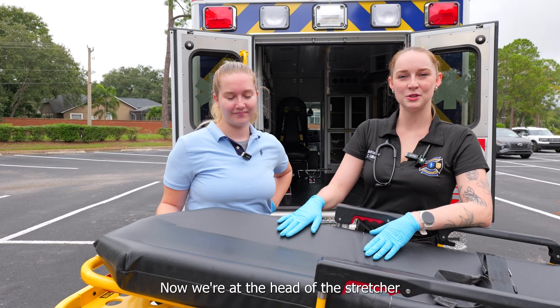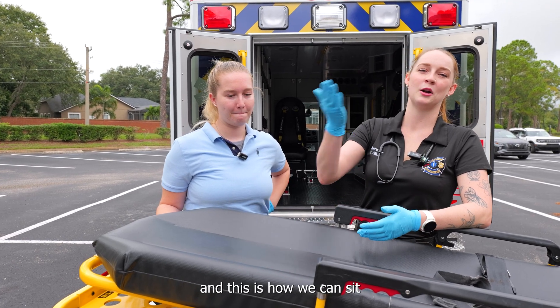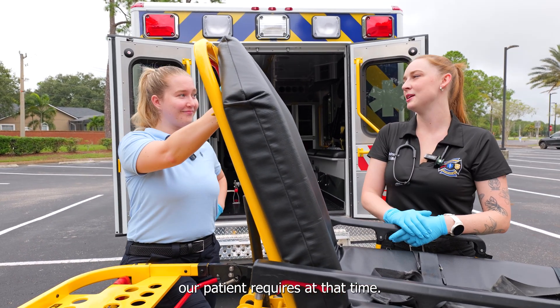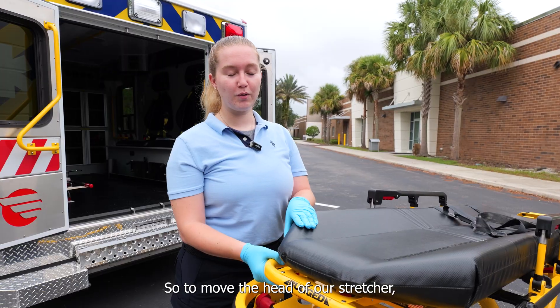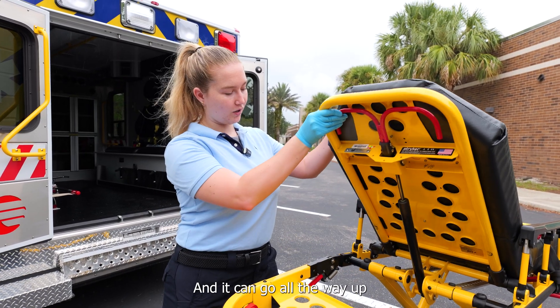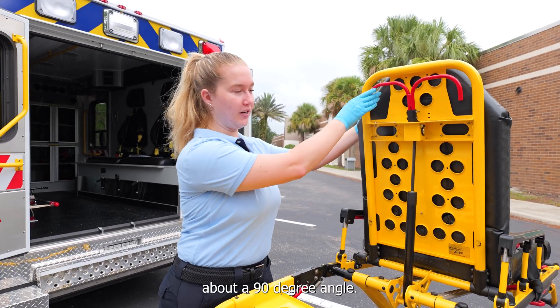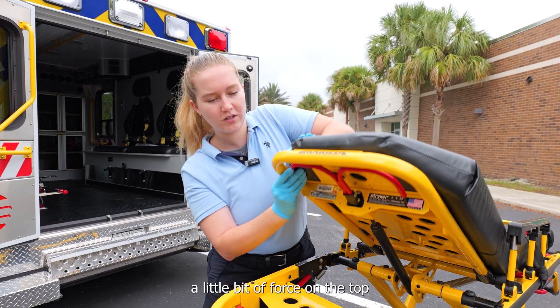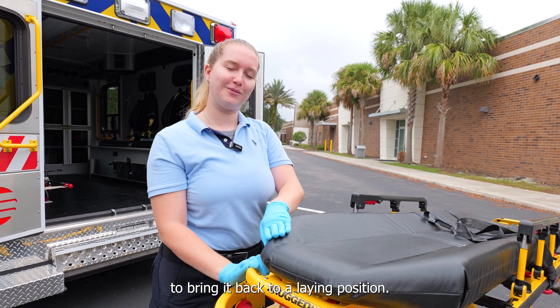Now we're at the head of the stretcher and this is how we can sit our patient up or lay them down depending on what our patient requires at that time. To move the head of the stretcher, we use this red lever and push it in towards the patient — it can go all the way up to about a 90-degree angle. Then to bring it back down, you do the same thing: push this in towards the patient and you'll need a little bit of force on the top to bring it back to a flat position.